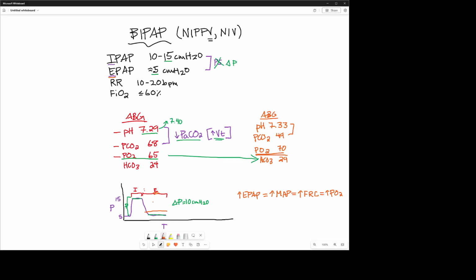In typical normal ventilation modes, a ratio of 1 to 2, you are increasing the baseline pressure for twice as long as during the inspiratory cycle. If you look at this as a 1 to 2 ratio, typical breathing pattern, and increase the 2 side, the expiratory side, you're bringing up the average pressures much more than you would by increasing the 1 side or the inspiratory side. So that's one way that you can kind of keep that straight.